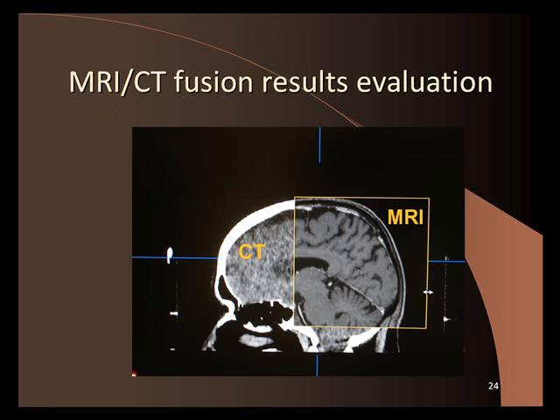And so this is what a fusion result would look like on a screen on our treatment planning computer. We fused an MRI to a CT. Okay, and you can't see too much common. You can see a ventricle here. This black part here is a ventricle. It's fluid filled, and that's overlaid on this ventricle. We can move this window around to evaluate how good the fusion is.